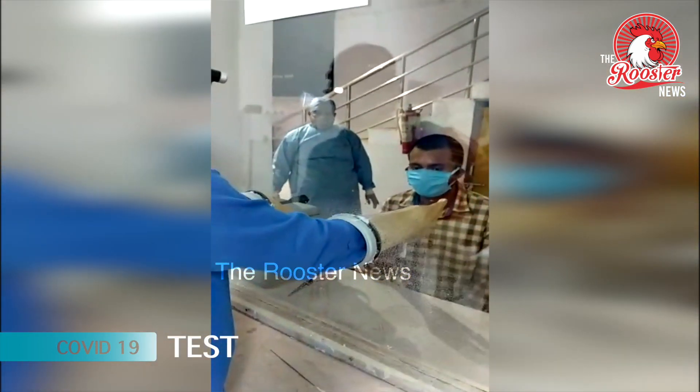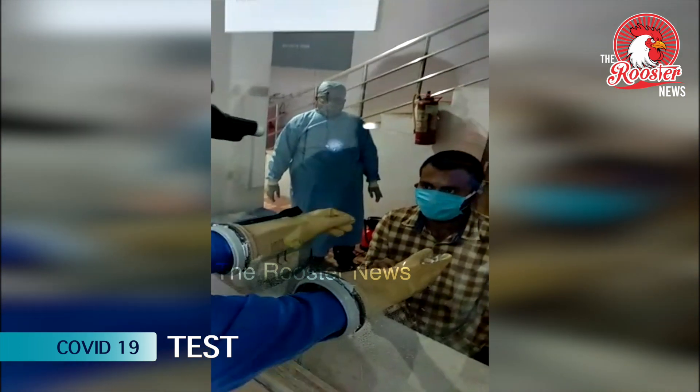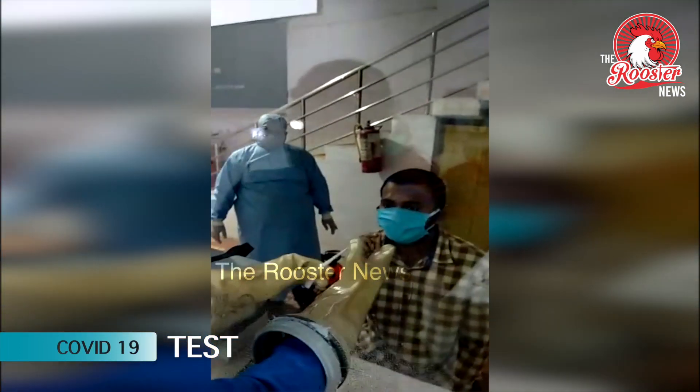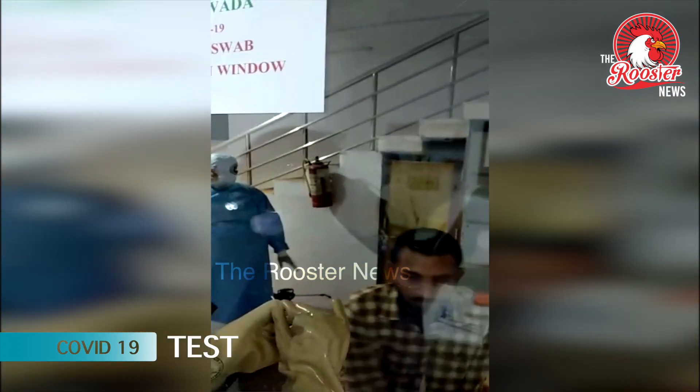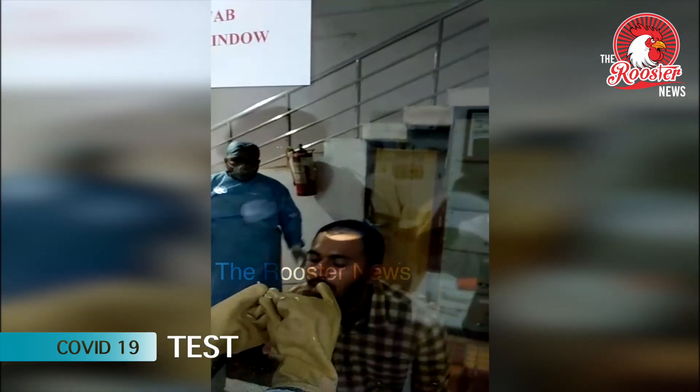The doctor is inserting his hands again through the glass pane. He has taken the swab, removing it and taking it out. That is the swab with which the sample is taken from the throat.